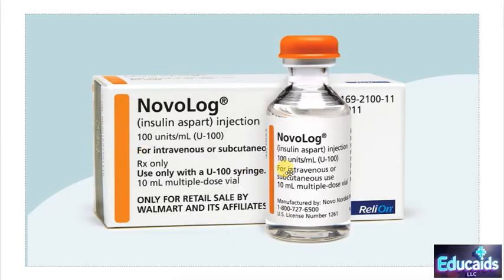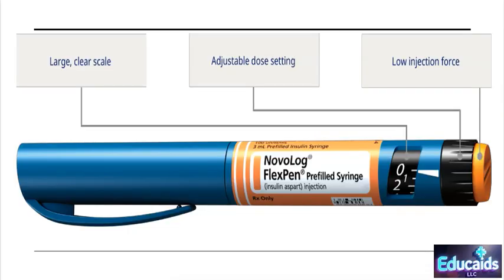This is what Novolog looks like in a vial. You can see the orange right here. It's 100 units per milliliter. That's the standard concentration. We've got 10 milliliters in this one vial. This is what our Novolog pen looks like. Oftentimes this is what's used in the hospital now. Again, you can see the orange here. Associate that with your race car and that it works really quickly.